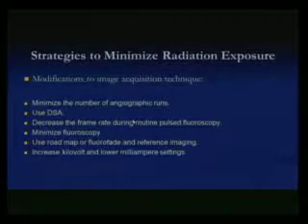And strategize to minimize the radiation exposure. Whenever we do procedures, we do procedures every day, so we have to make sure we are protected, and obviously the patients are protected too. You have to watch the fluoroscopy time also. The modification to image acquisition technique is to minimize the angiographic runs and use DSA, which can also minimize the contrast use. Always tell the tech to decrease the frame rate and use the minimum fluoroscopy time.